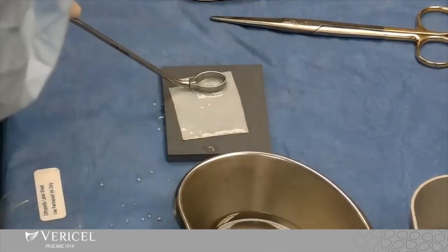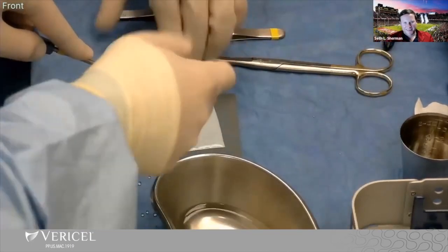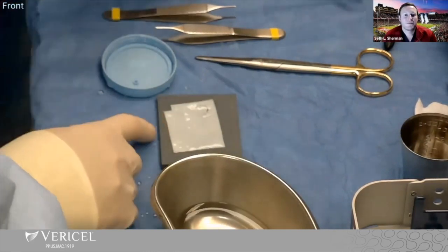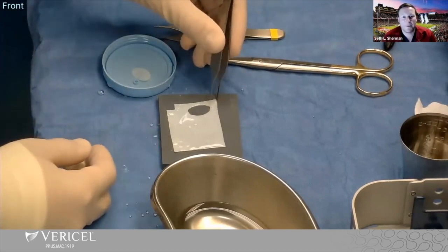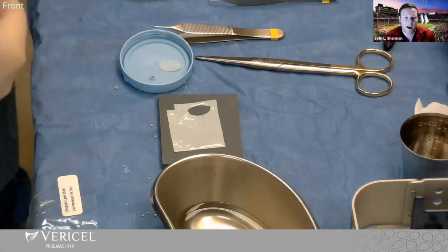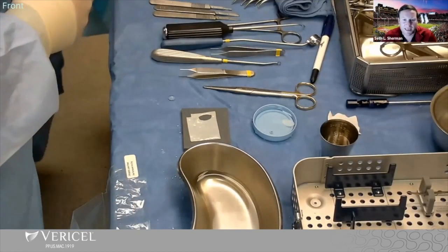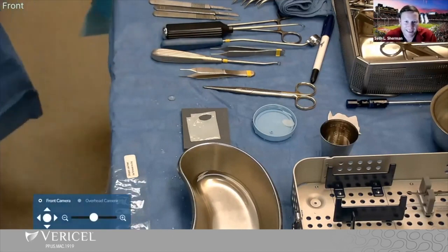When you do this, you can see he hits pretty hard. With smaller guides you don't have to worry about the hammer going all the way through, but with bigger ones be a little more careful. The biggest problem when you do this is you don't hit it hard enough — everybody gets freaked out. You've got to hit it fairly hard to get it cut all the way through. Then you've got a nice cut. The cell side is up when he cuts it, and the cell side will be down — that's the rough side down when you put it into the defect. The smooth side is up. That orientation with the notch is critical, especially for odd-shaped defects. We submitted an abstract looking at cutting versus manual, and found no significant differences in viability with hitting it hard around the edges, which validates this technique.